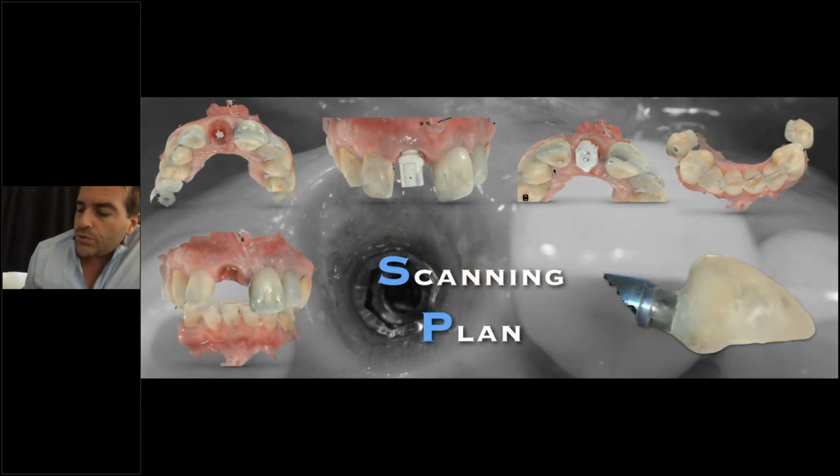Then, of course, we need to understand what are the scans that we need to detect. So not only the scanning strategy, but also what are the scans that we need to take and to share with our lab technician to finalize this restoration. So you see that I'm starting from the intraoral scanner, and I will bring you to the end of this restoration exactly as a recipe from A to Z.